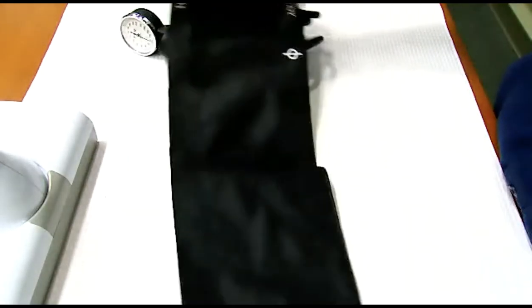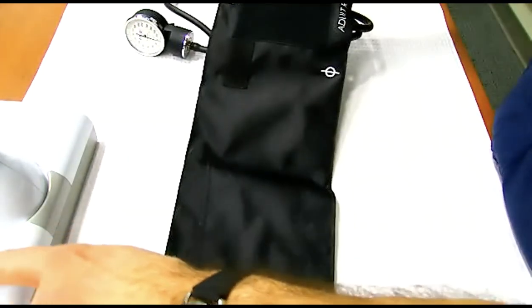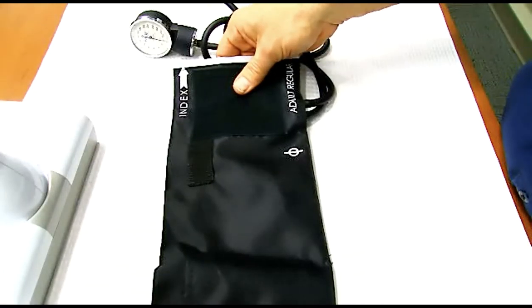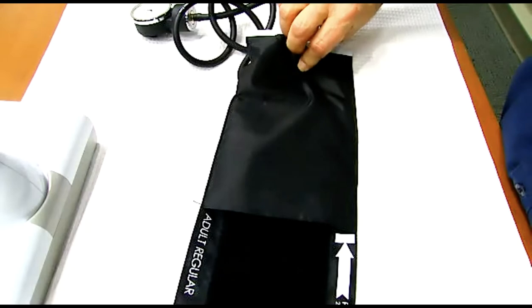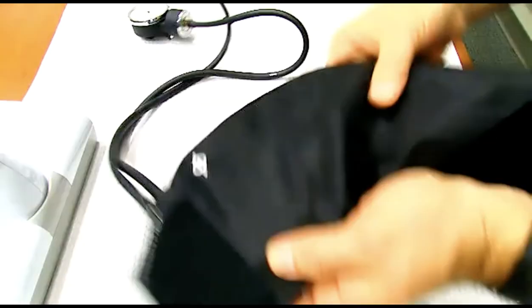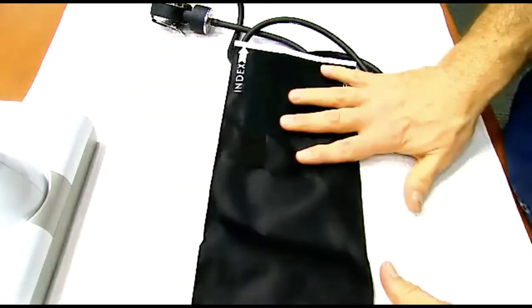You need to put it on the patient the right way. And let me try to lighten that up a little bit so you can see. Because here's the deal. Is this the outside or the inside? You see where, and is this the top over here? Does it go like this? Or does it go like this? So you need to know, kind of get oriented to the blood pressure cuff.